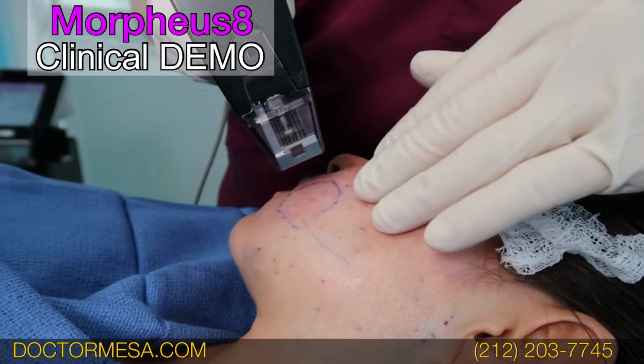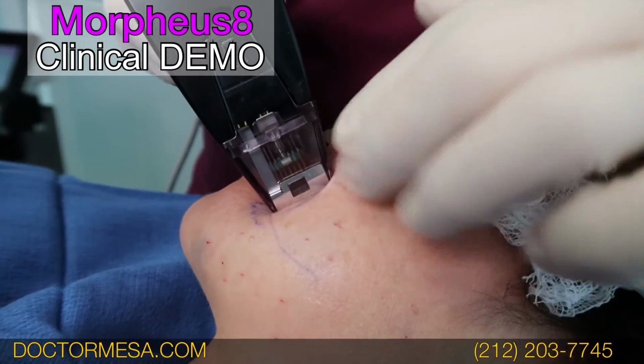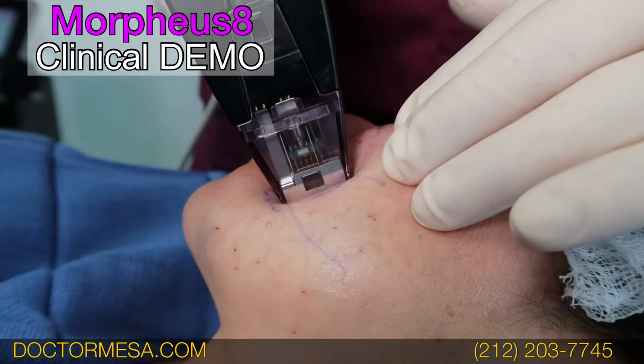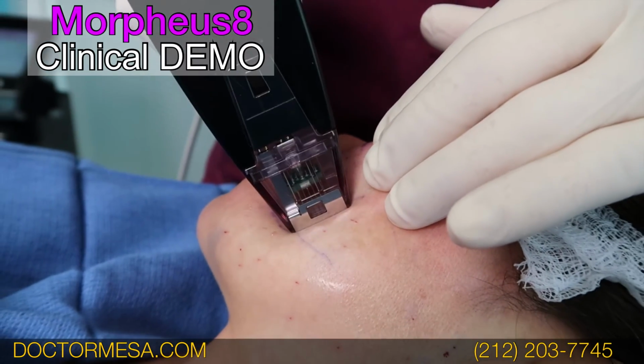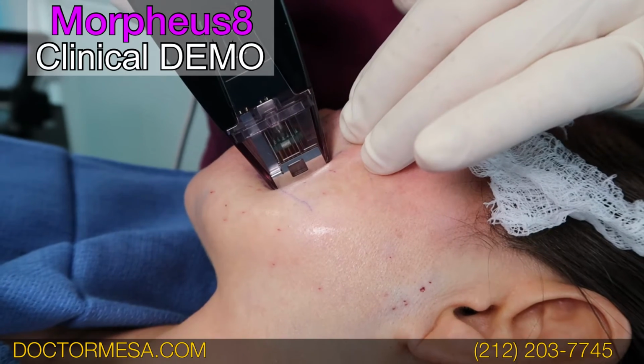Let's see if we get a close-up with the camera and look at the needles, the pins here, how they go deep into the skin. And when they go deep, they go underneath the skin and melt the fat away.